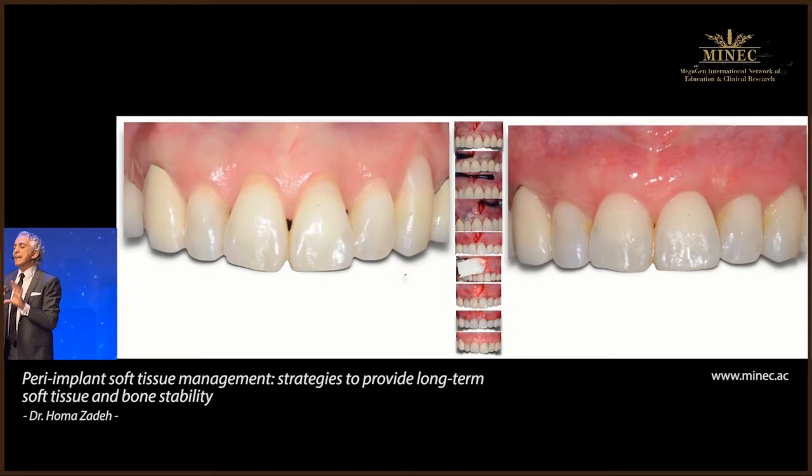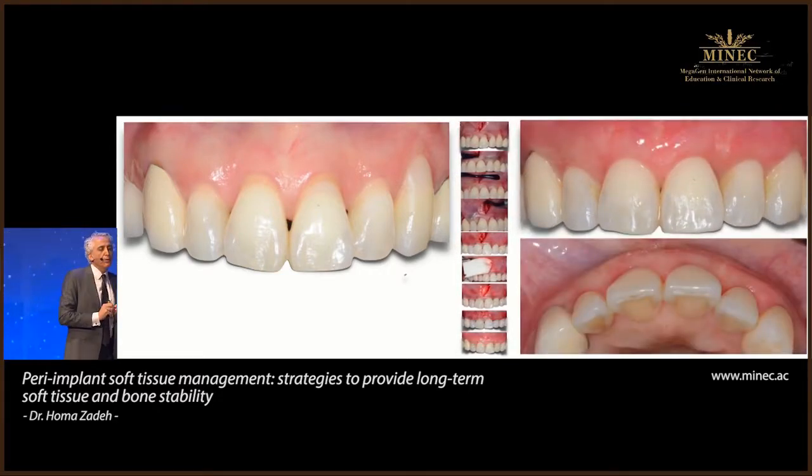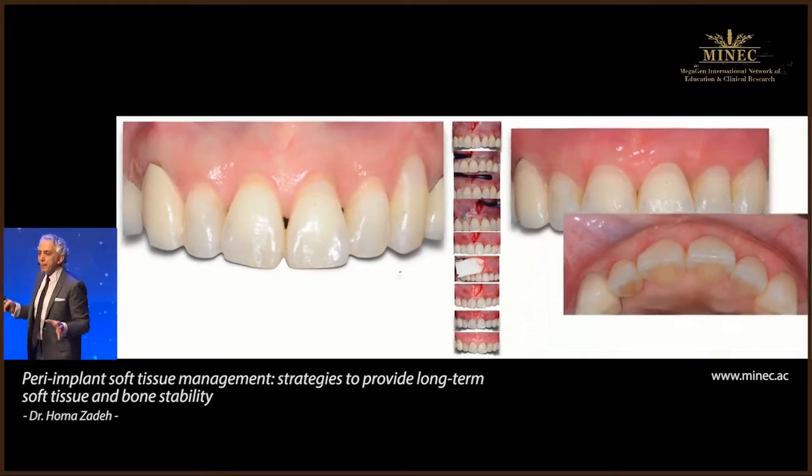And we can see that what is really very helpful in these cases is increasing the mucosal thickness. That's what we really look for. The primary goal is increasing the mucosal thickness. And because in this case, you don't elevate the papillae, you don't make any surface incision, it is very helpful to actually give you some bulk of the tissue.